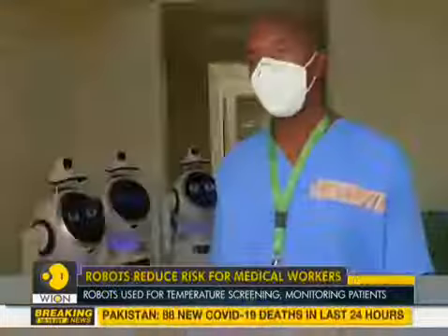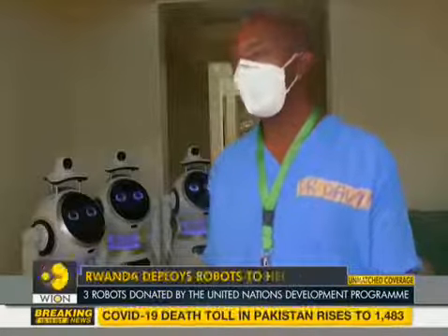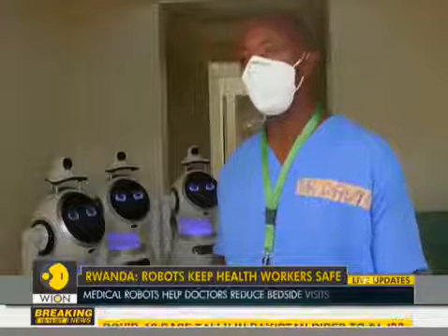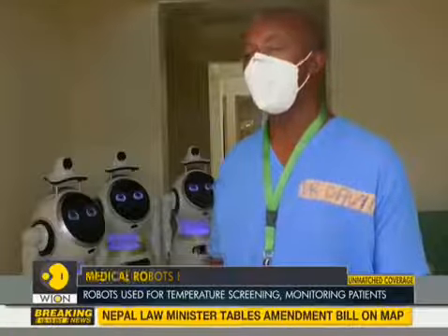They help us to decrease or reduce the risk of transmission, that means from patients to staff. So what they do is like 50% of the technical work. They take vitals like temperature. They record messages that give us feedback in terms of clinical judgments.